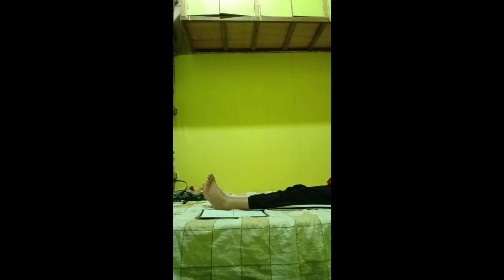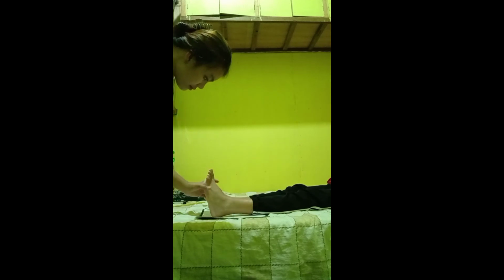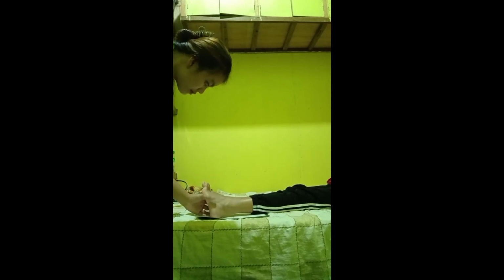From AP of the patient ankle mortise, rotate the leg and the foot internally 15 to 20 degrees, until the malleolar plane is parallel with the IR.